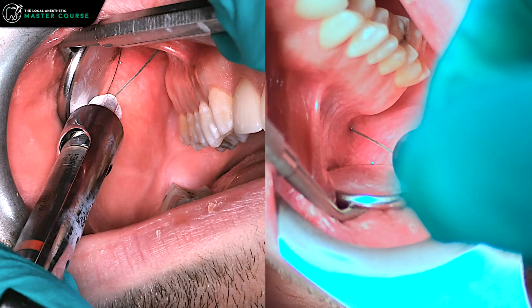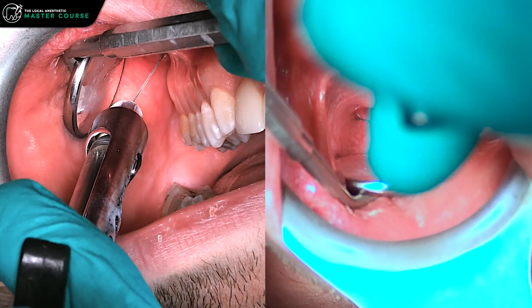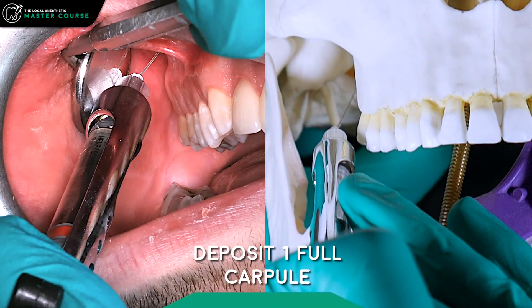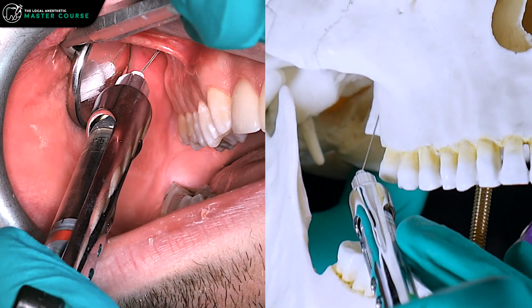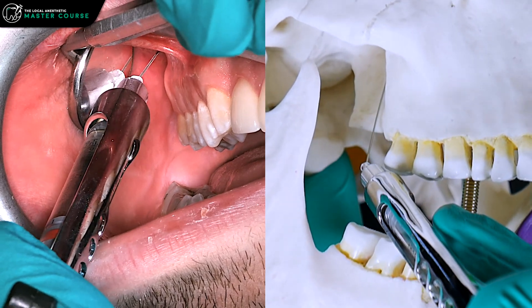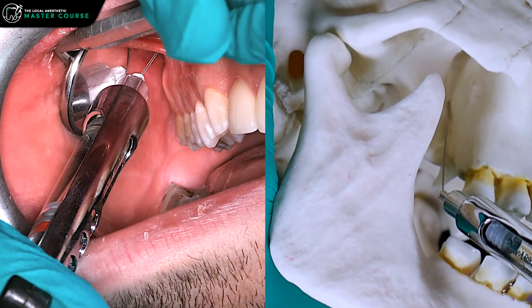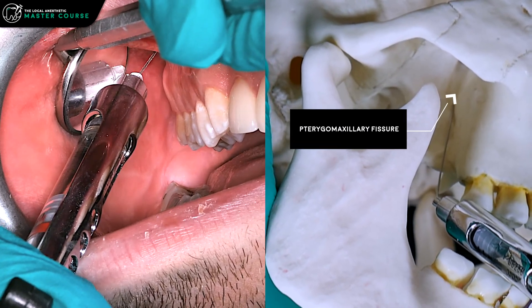If you hit bone too soon — like here — withdraw and come out to a greater depth. Once you're at the right depth, start depositing anesthetic, and make sure you aspirate, because this is a highly vascular area and actually one of the injections most likely to produce a hematoma. If that happens, apply good sustained pressure up in the vestibule back there.